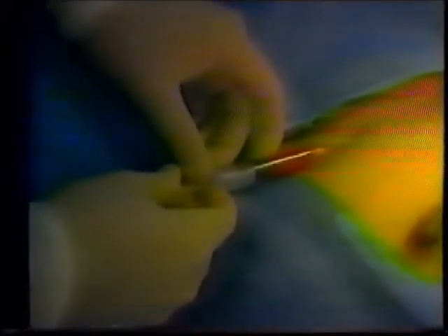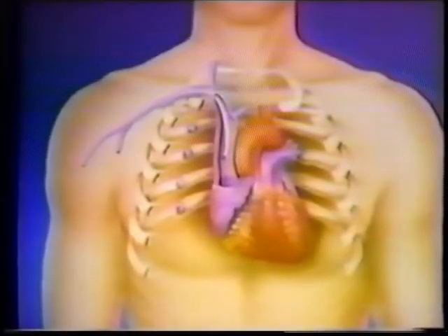After placing the patient in the Trendelenburg position, use the supplied 18-gauge by two-and-a-half-inch needle and syringe. Enter the vein and obtain blood return. Remove the syringe and insert the J-tipped guide wire through the introducer needle, using the blue straightener to straighten the J. X-rays should be used to confirm guide wire placement. In order to avoid catheter pinch-off, care must be taken not to place the catheter too medially into the angle between the clavicle and first rib. If placement is proper, remove the introducer needle, leaving the guide wire in place.